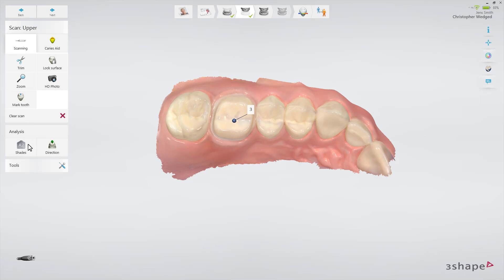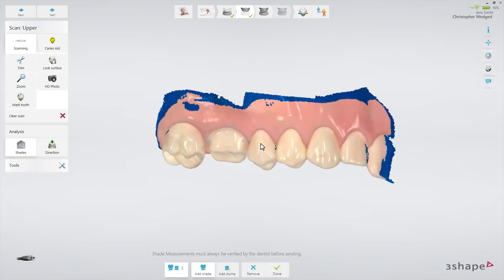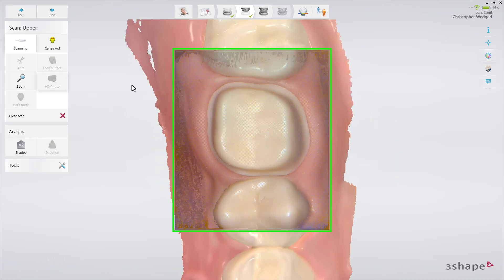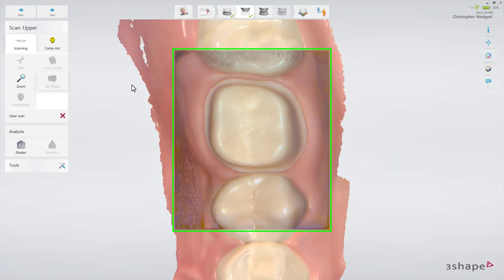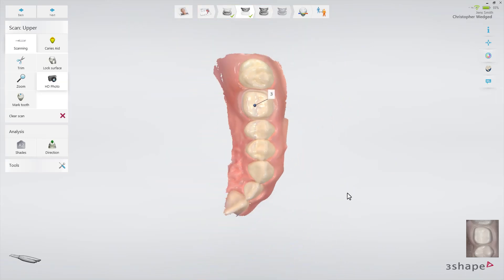Having the surface scans taken, you have the opportunity to take a shade measurement and take an HD photo. An HD photo may be useful for the lab to set the margin.